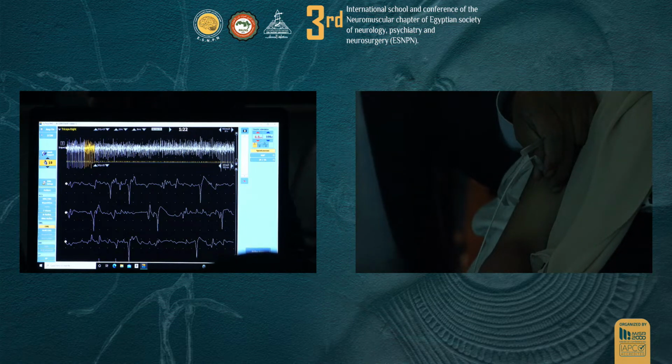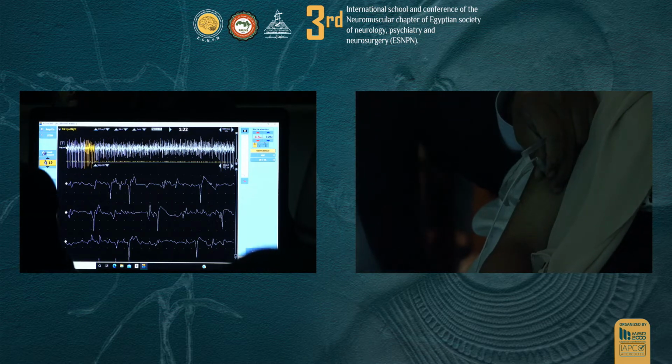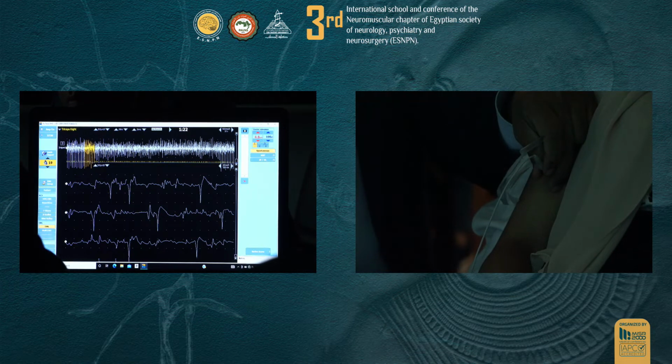So the best way to calculate that is by finding a motor unit, finding the frequency of that motor unit, and then dividing by the number of motor units to see. In this, you can see many more motor units than that. Is that good? That's one concept I wanted to show you. So this is a myopathic motor unit. There's no spontaneous activity, myopathic picture.